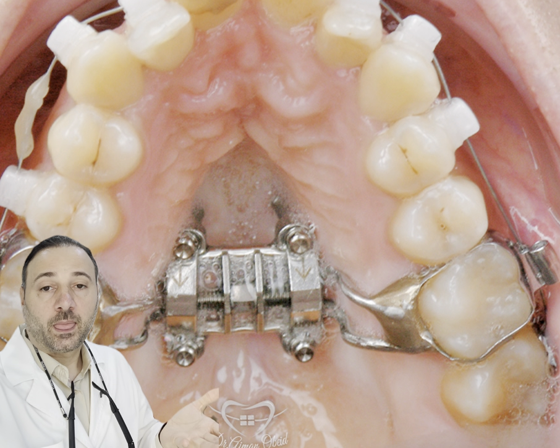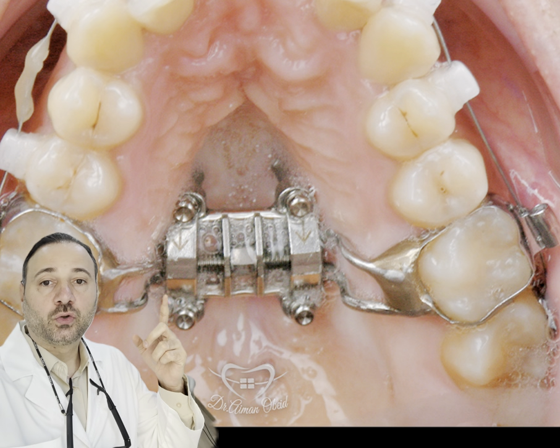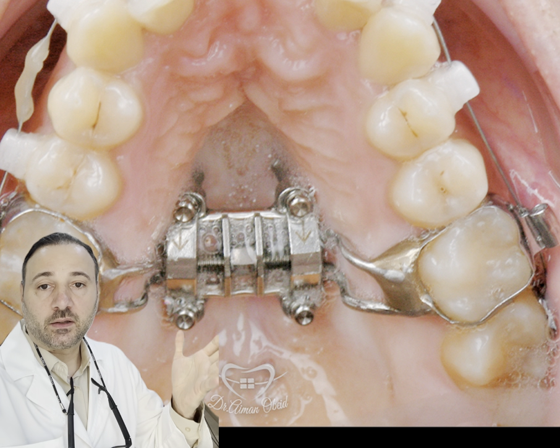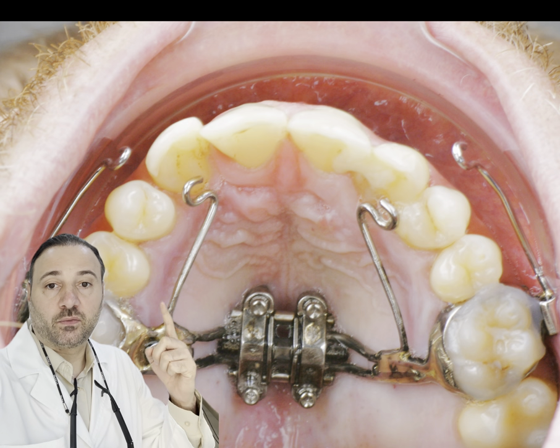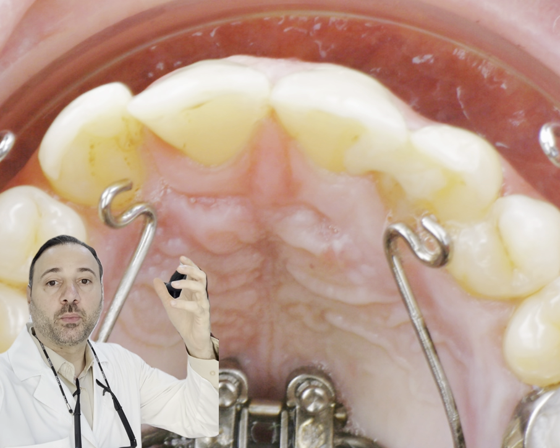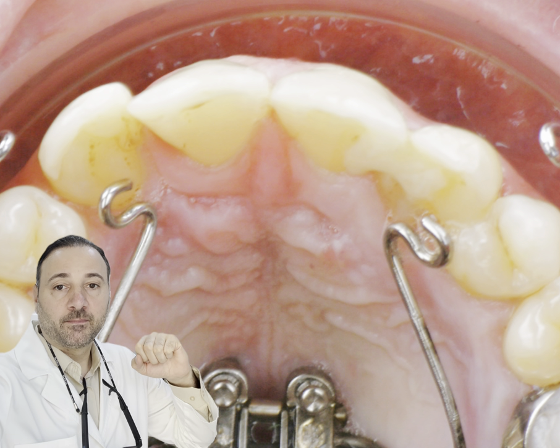We can also use palatal TADs to apply different types of forces — distalizing or bringing the upper teeth backward, or mesialization, as shown in this photo. These hooks can be used later to bring the upper teeth forward.